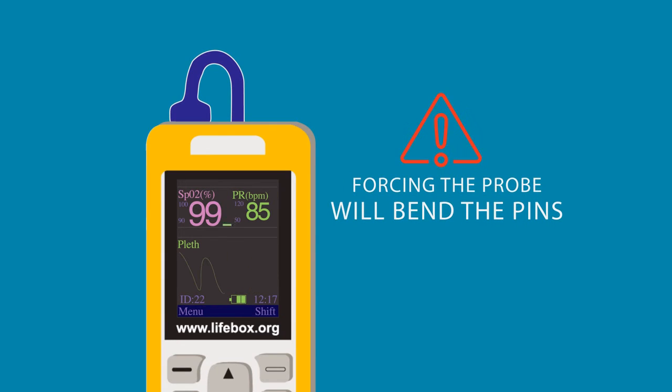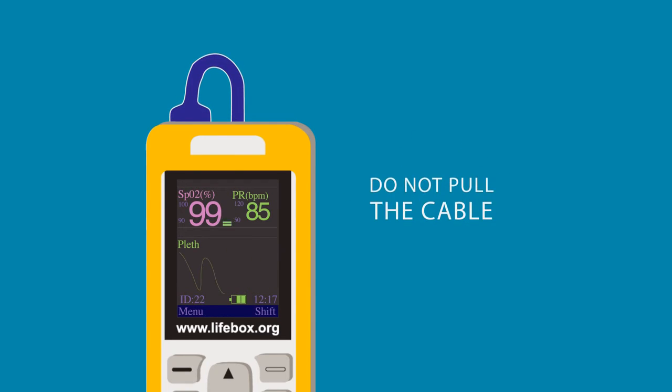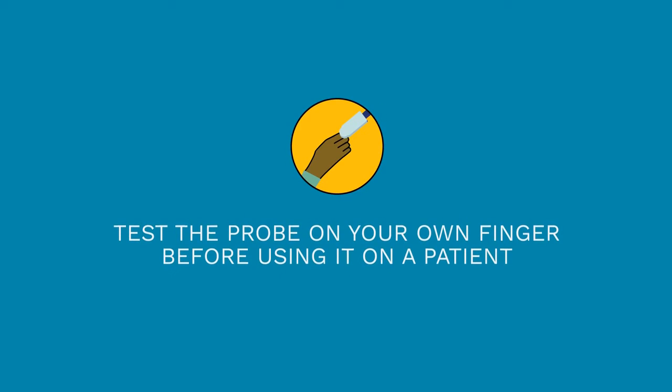If you force the probe in upside down, you will bend the pins and the probe will no longer pick up a reading. When disconnecting and connecting the probe, grip the end firmly. Do not pull the cable, to prevent the small wires inside from tearing. Test the probe on your own finger before using it on a patient. Assuming you are healthy, you should get normal readings for your oxygen saturation and heart rate.